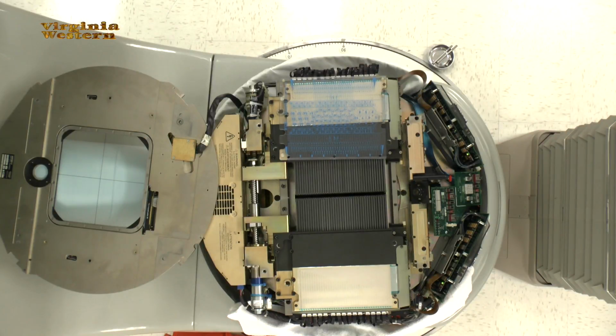So now what it's doing, it's closed the leaves, and it's running each leaf pair, and it's testing how good that spring is that was in the system.